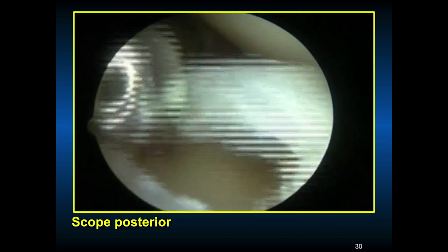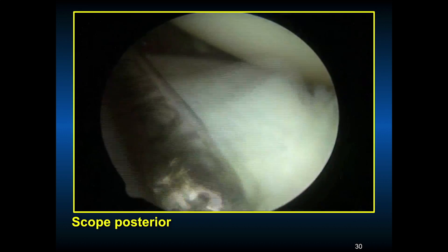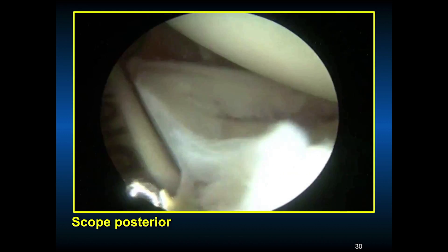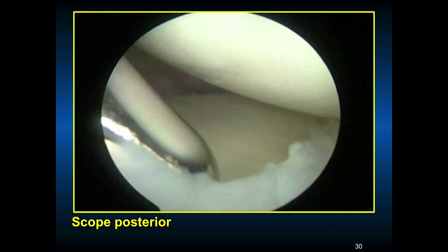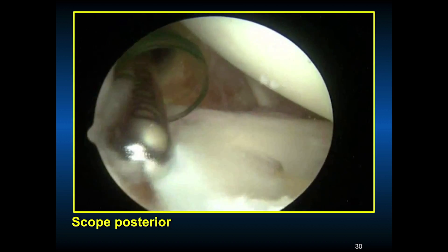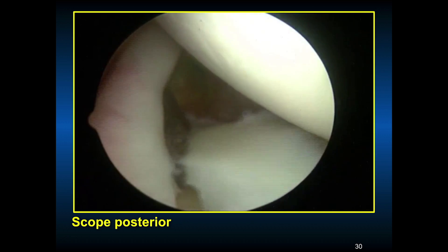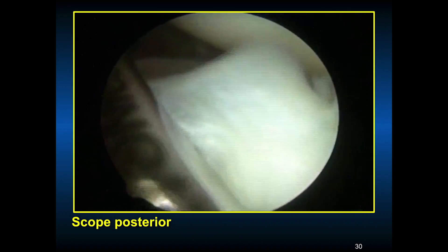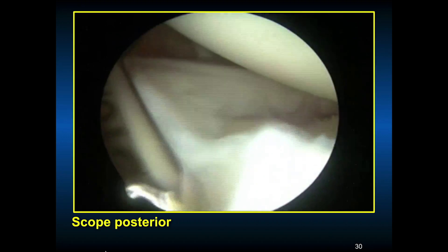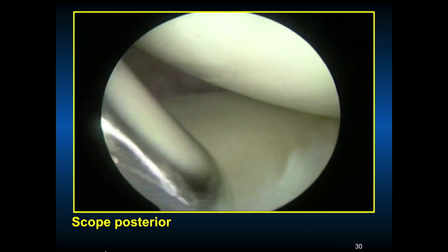The cannula is in the front as a working portal. Debridement is being done, trying to remove as little tissue as possible, assessing if this bucket handle tear can be repaired. It looks much like a bucket handle tear of the meniscus. After deciding on the vascularity pattern, unfortunately due to the chronicity and lack of vascularity, this bucket handle tear was resected using a motorized shaver. Arthroscopic scissors and a Schlesinger clamp can also be used to remove it.